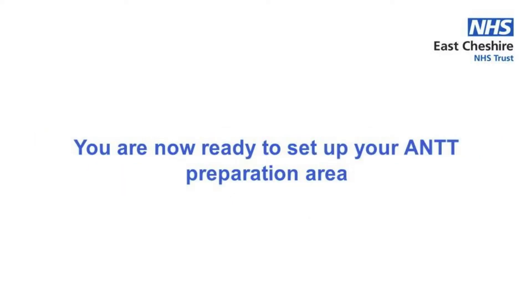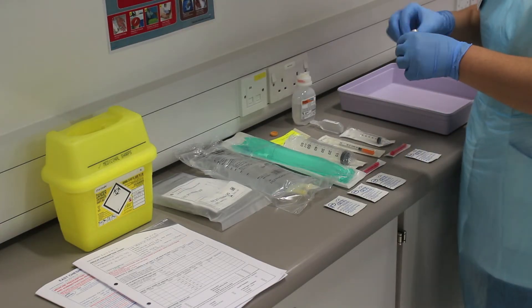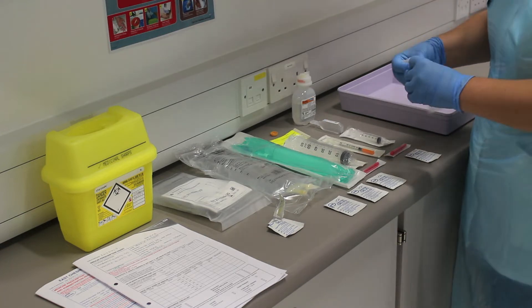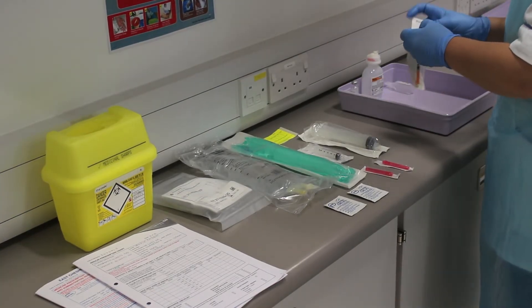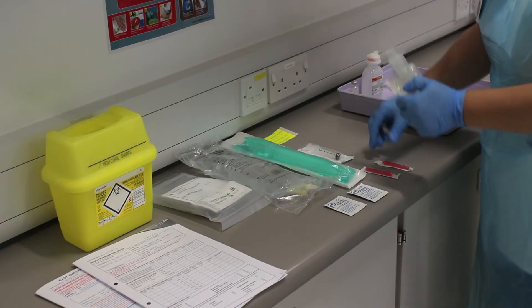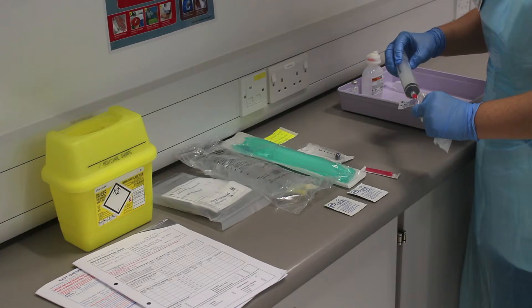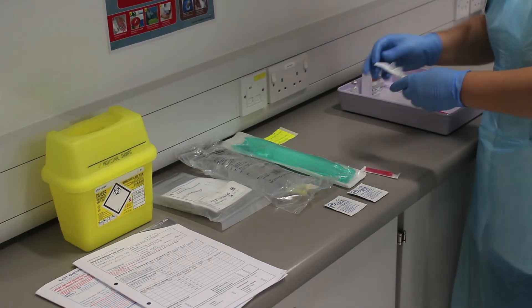Once you have everything you need, wash or decontaminate your hands again and put on an apron and gloves. You can now begin to set up your ANTT preparation area in your clean tray. Open your insulin vial and decontaminate with disinfectant wipes before placing it in the tray, taking care to clean and protect the key parts as you do. Repeat this process with the sodium chloride bottle and ampoule. Remove each of the syringes from the outer packaging and place in the tray, attaching the needles to both of the IV syringes before you do so. Don't forget to also place your extendable line in the tray, just opening the end slightly of the packaging to allow attachment to the syringe. Try to always keep your preparation area clear from rubbish and discard this as you proceed.